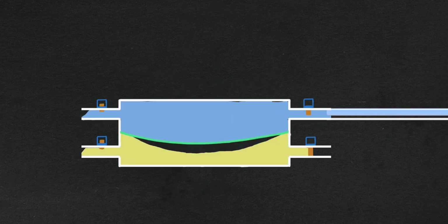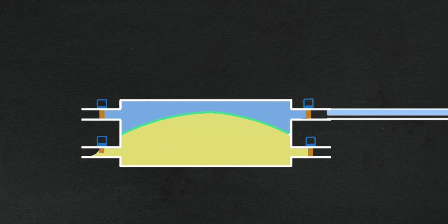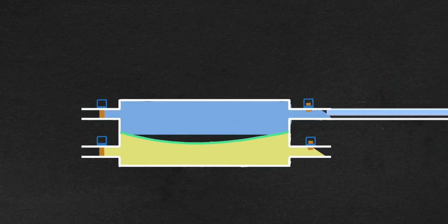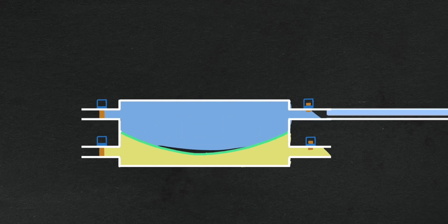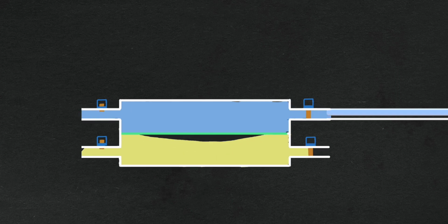As one chamber is filled with fresh dialysate, the other chamber is filled with spent dialysate, which in turn pushes the fresh dialysate towards the dialysis circuit, and the sequence repeats itself. The rate at which the solenoid valves open and close depends on the dialysate rate prescribed.